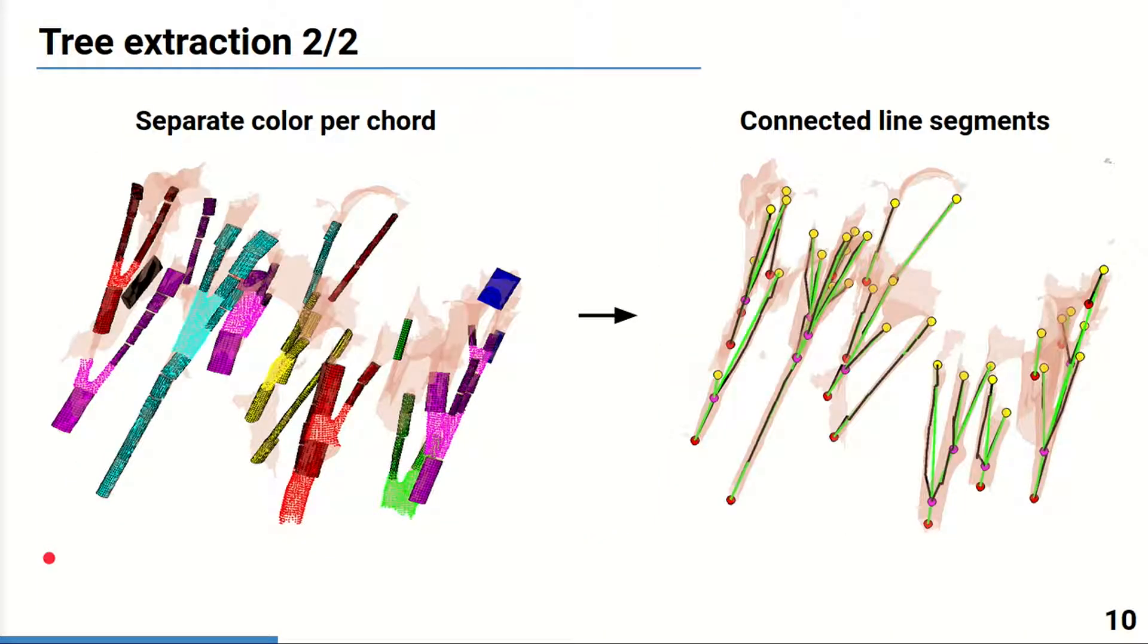Here you can see an example of resulting trees of connected cylinders and branching zones. Each chord is shown in a separate color. The approach allows to segment the complex chordae structures with multiple branchings. The cylinders and branching zones are then represented as line segments, as shown on the right in green.